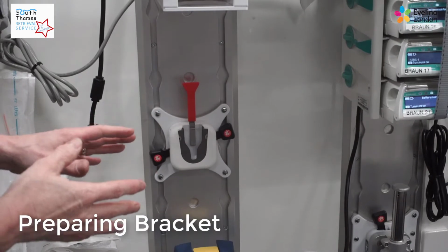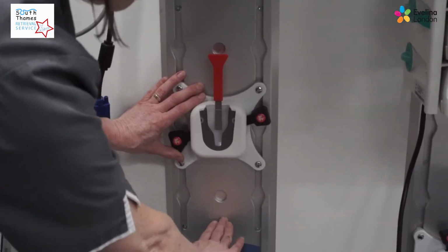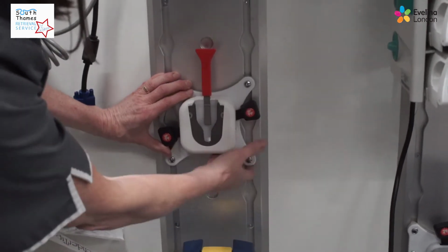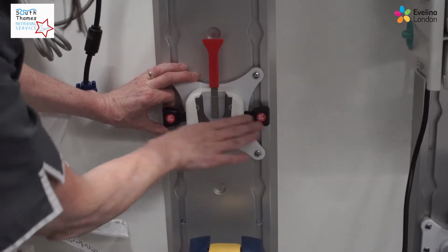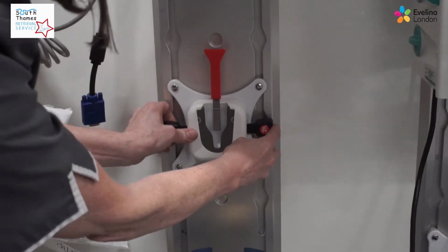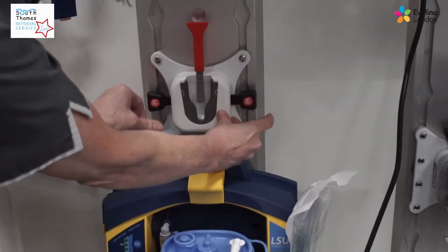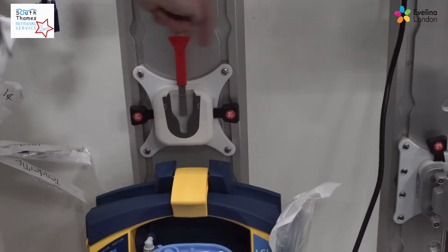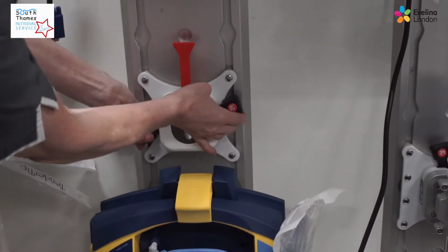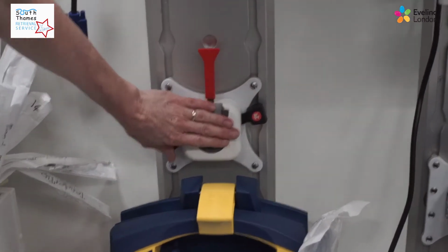So to prepare the brackets ready for the nitric patient, you need to first lower the ventilator bracket down to the same level as the suction. To move the bracket, get the black lever into the horizontal position, lift it forward and it will start to slide down until it catches. Make sure it's in the right place and that all four legs are nice and secure in the actual track, and then you need to secure it by putting it into a diagonal position. So your ventilator can go there now.